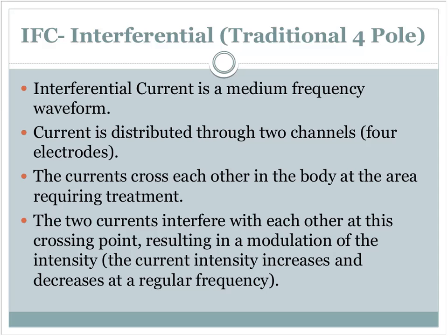What that basically means is there's a carrier wave. And that carrier wave is extremely high in its frequency. We're talking 3,000 to 4,000 hertz. So think about, you got 3,000 to 4,000 individual cycles in a second. Okay, so it's a very, very high frequency. But that's the carrier wave. So you may have the medium frequency waveform. So it's putting the wave that's the treatment wave onto this carrier wave.